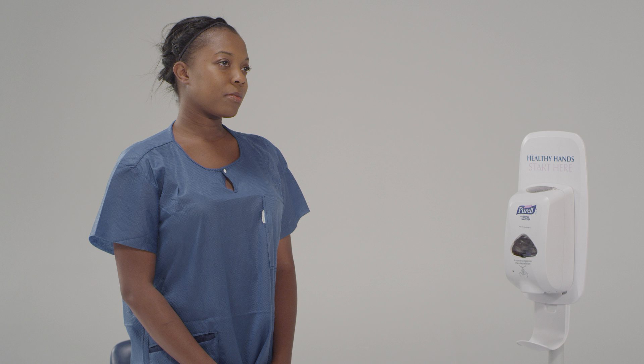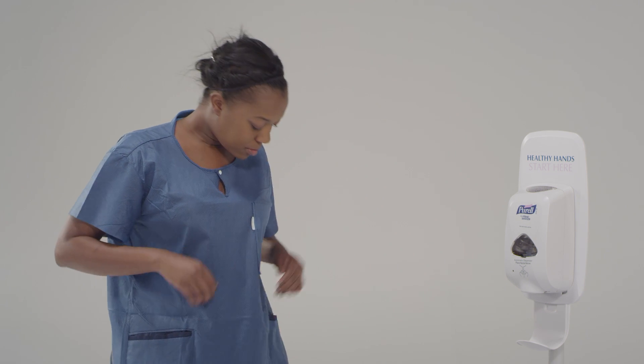Ensure your nails are no longer than a quarter inch so they do not puncture the gloves. The first thing I need you to do is remove any jewelry, earrings, rings, watches, anything that might be around your neck or waist. Please make sure that you also don't have your ID badge on or pens or cell phones in your pocket. Let's make sure that your hair is pulled back off of your face and also off of your neck and back.